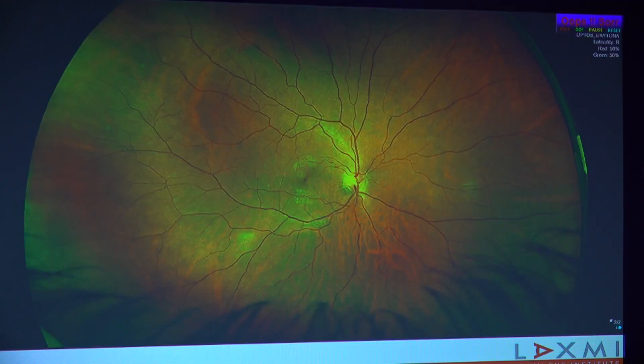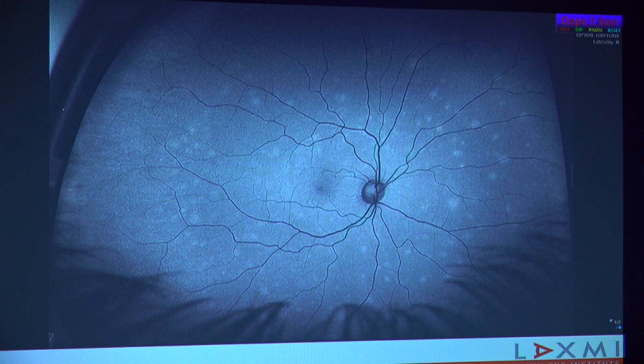This last patient had very vague visual symptoms. Detailed fundus examination showed only very few spots not even visible on the color fundus, but when you do the autofluorescence, you can see numerous spots in a white dot syndrome pattern — telling us that this is a white dot syndrome, and allowing you to see the full extent of those lesions.